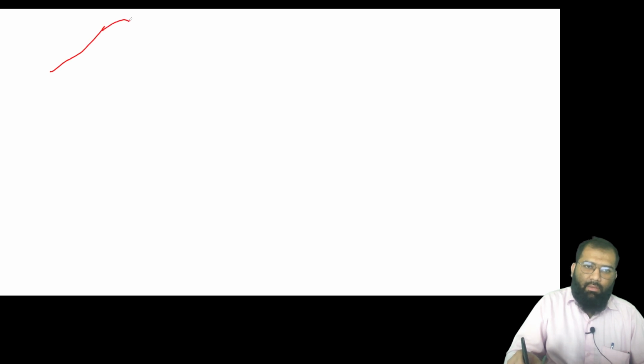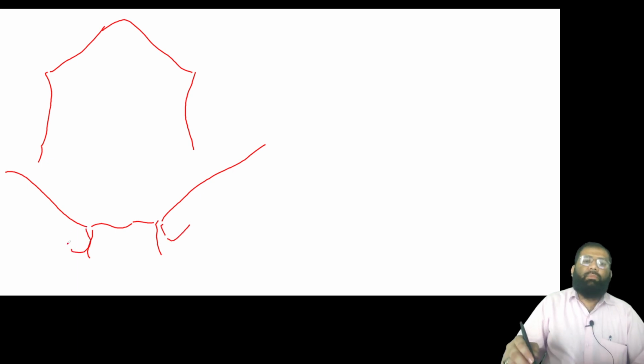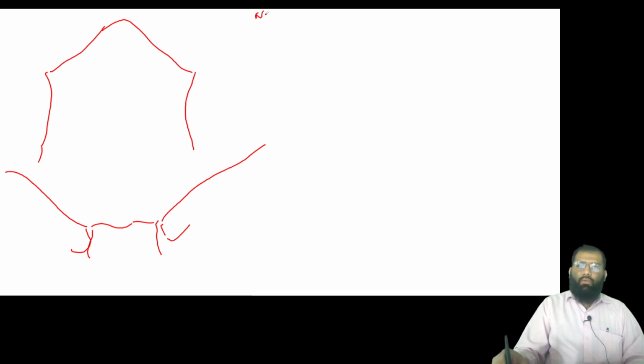For example, if this is the mandibular lining, the neck should be well exposed. The entire neck should be well exposed. Along with the neck, the clavicular region should be exposed. The region of manubrium sterni, so suprasternal notch. Here lies the manubrium. Here is the joint with the clavicle. So this entire region should be exposed when you want to examine for either neck or you want to look for thyroid. Any of this is the basic prerequisite when it comes to examining thyroid or neck.